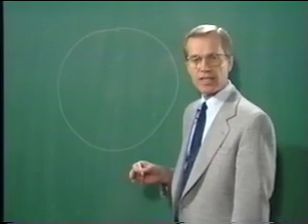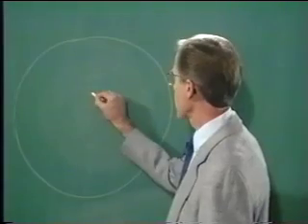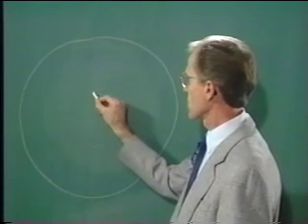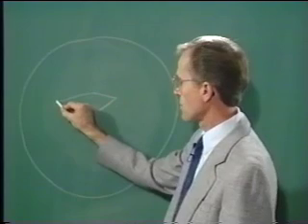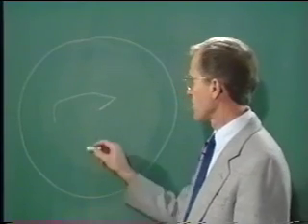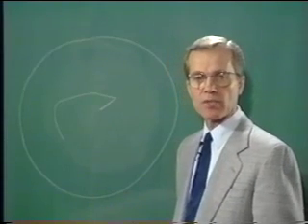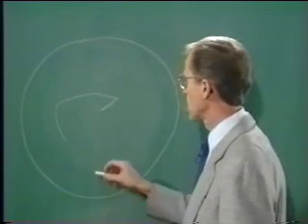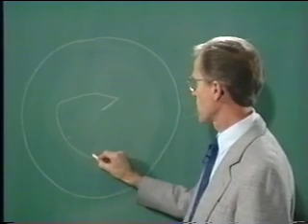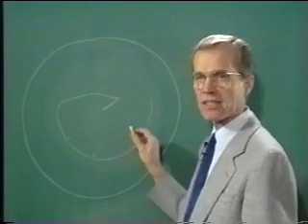So I recommend central puncture. This central puncture can be made, as you saw in this case, either with the forcep — though more commonly a cystotome is used. We make this central puncture, and I recommend a somewhat horizontal triangle, then extend it just a ways with the cystotome, maybe even out to the radius you want to start the tear, and then change to the capsule forcep, which will give you ultimate control as you extend it around in a curvilinear fashion. You may need to change the grasp of the edge with the forcep many times to maintain the best control — re-grasp, extend a little farther, re-grasp again.